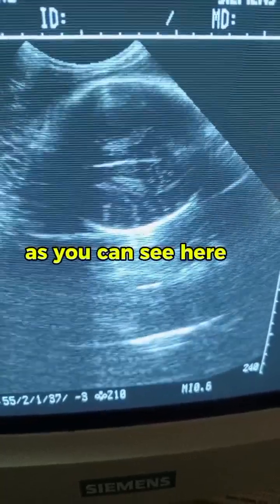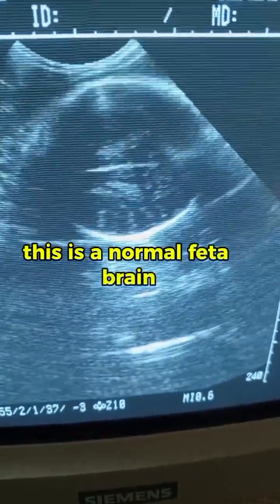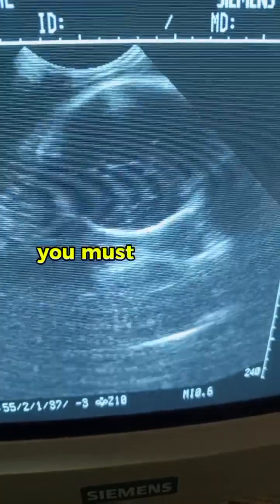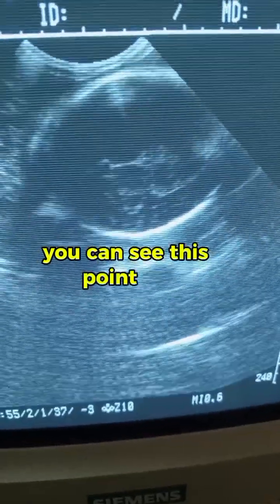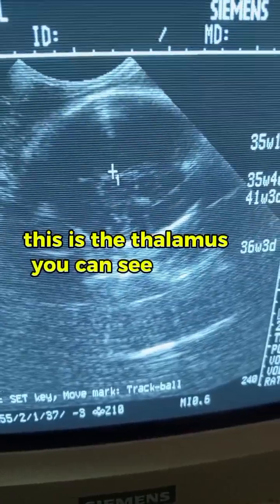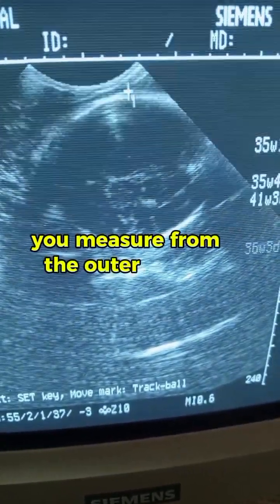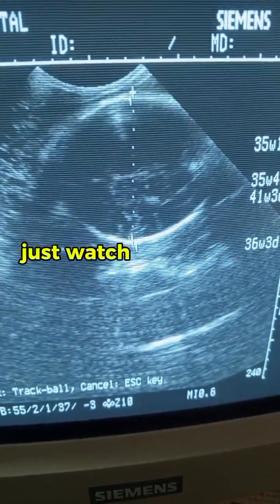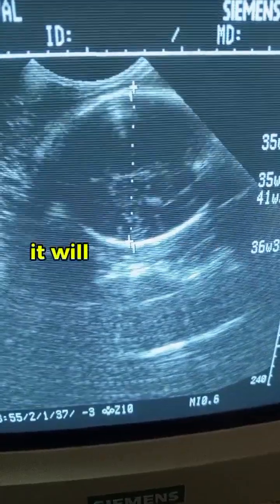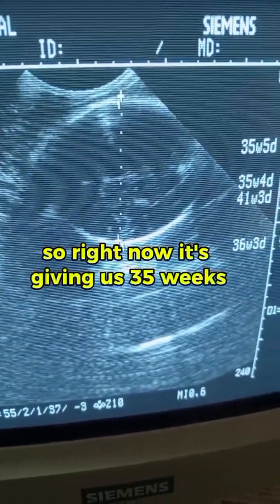As you can see here, this is a normal fetal brain. If you want to measure the BPD, you must get the thalami. You can see this point. I want to point like this. This is the thalami. If you want to measure from the outer to the inner, just watch the way I'm measuring it. It will give you the BPD. So right now it's giving us 35 weeks, 5 days.